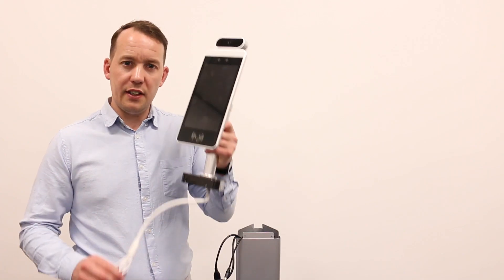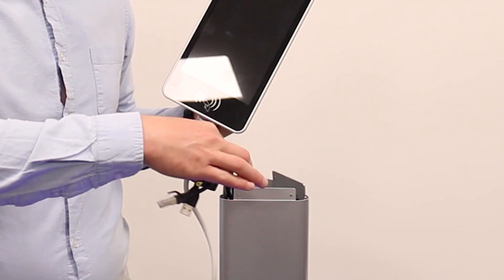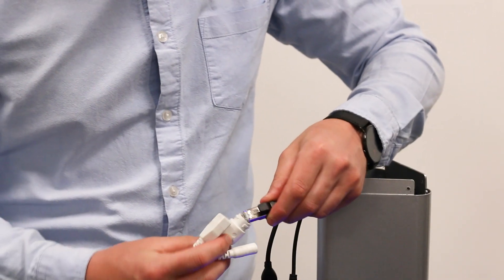Step one is to connect the device to the pedestal unit using the wires provided. Before we do so, we need to make sure all the wires are clearly pulled out from the pedestal unit, and we can now connect them safely to the device.